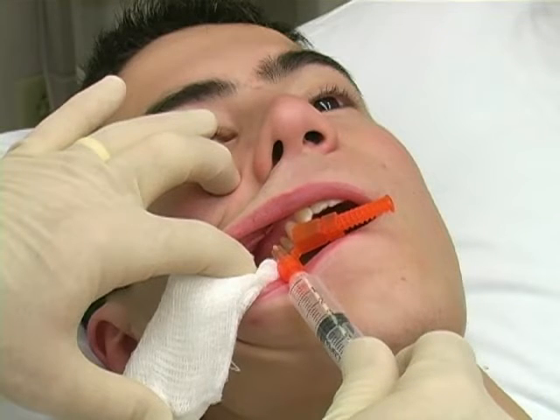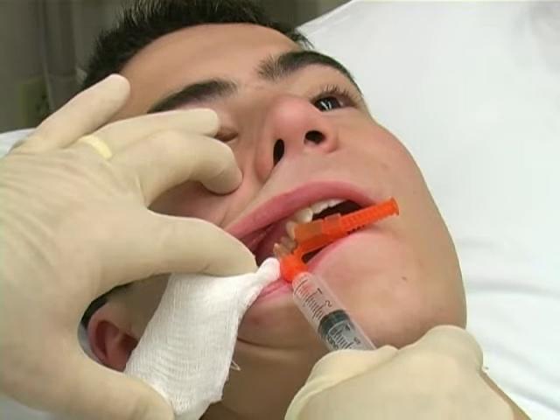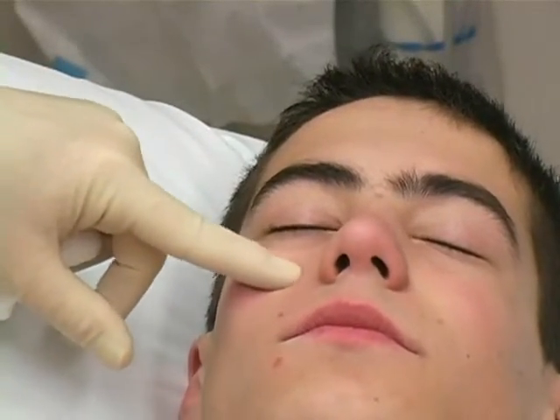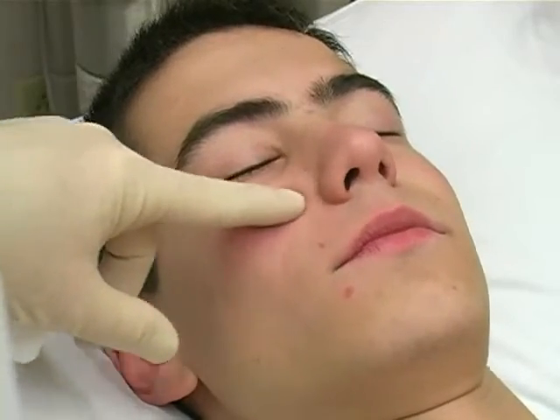Aspirate to rule out inadvertent intravascular placement, then inject 2 to 3 milliliters of solution adjacent to but not within the foramen. After injection of the anesthetic, massage the area for 10 to 15 seconds to hasten the onset of anesthesia.